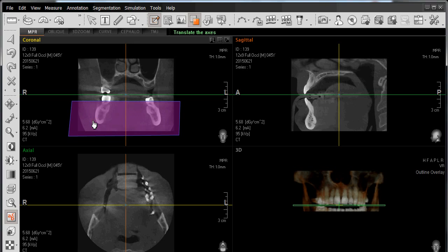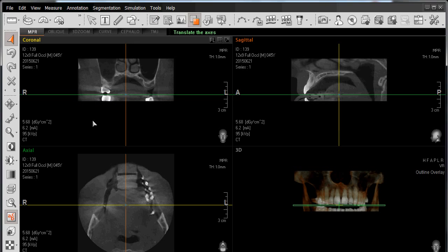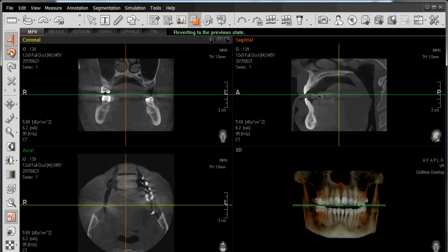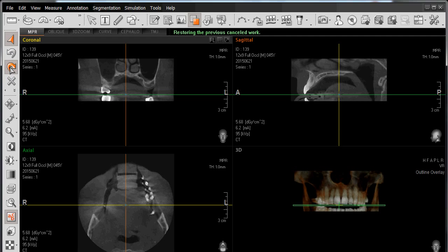I'll double-click and left-click to hide that area of anatomy. And if I choose to add that back in, I can left-click on Undo — it puts my anatomy back — then left-click on Redo, and it hides it again.